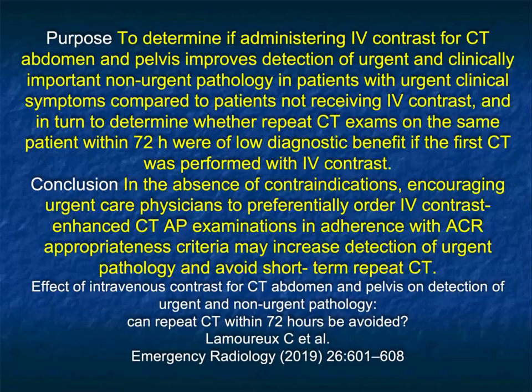Now, of course, one of the most important things in me reading a study or you reading a study correctly is the protocol. If the study's done well, you're going to be much better at being accurate. If the stomach's not distended, you didn't give oral contrast, how are you going to make a diagnosis of an early gastric cancer? If you do a study without IV contrast because you want to rush through things or there's not enough contrast, you're going to miss a lot of things.